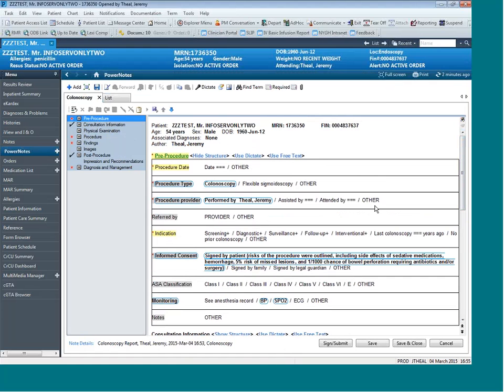have a complete note. One of the ways that we ensure quality with these notes is ensuring that we create fields that are mandatory so that the physician must fill those in before they're able to sign the note, and that way we don't have any missing information that might have accidentally been left out.